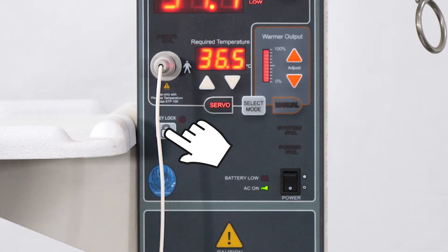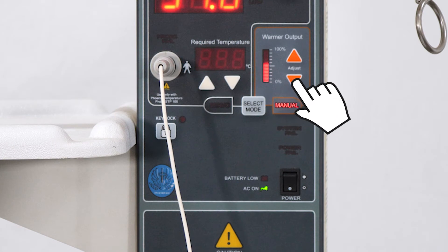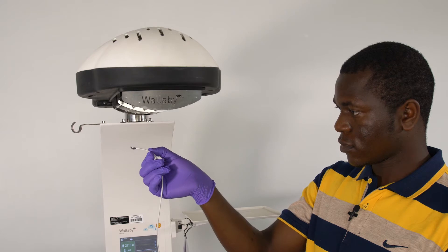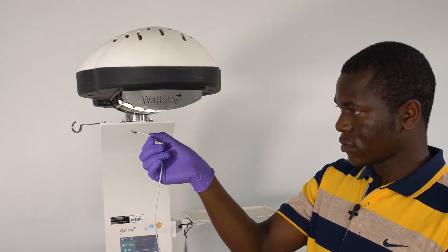When you are preparing for a baby to be moved under the radiant warmer, it is important that you warm the cot so that you are not putting the baby onto a cold mattress. To do this on the Phoenix radiant warmer, you need to have the machine in manual mode. Set the output level to 20%. Make sure that the machine is working by lifting the probe up towards the heating element.